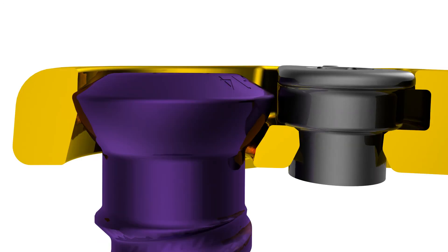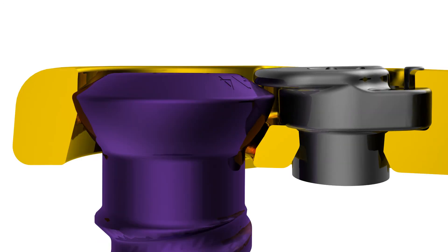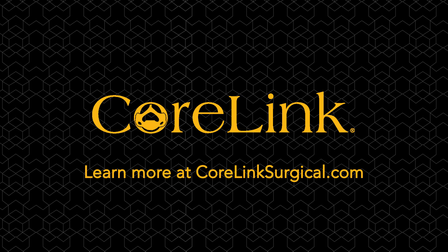This is a closer view of the locking mechanism. To learn more, go to CoreLinkSurgical.com.